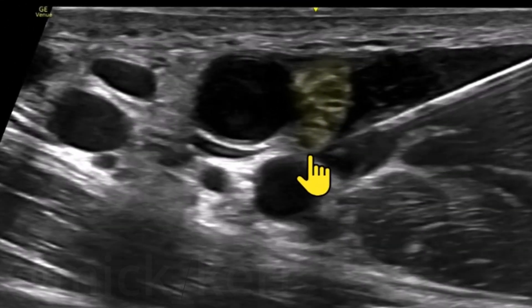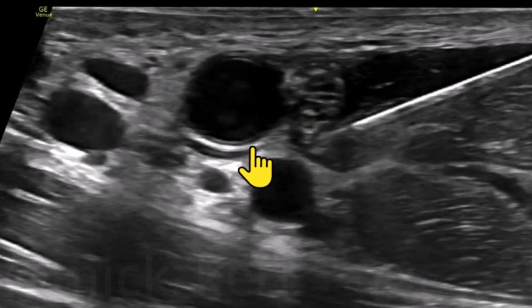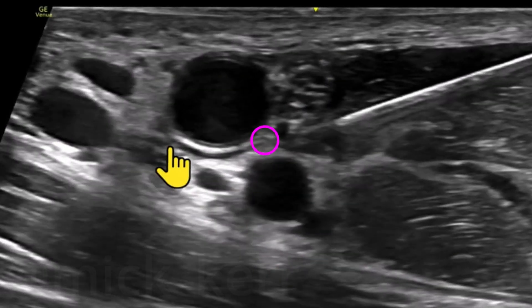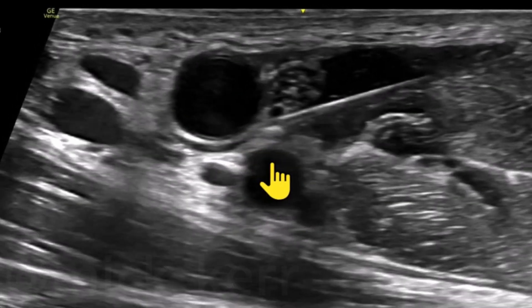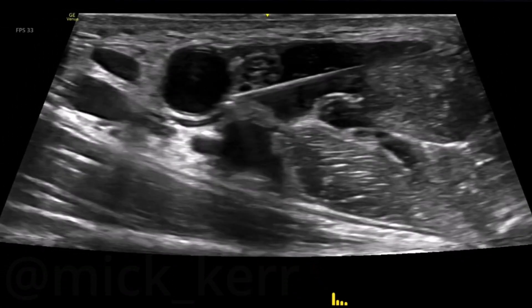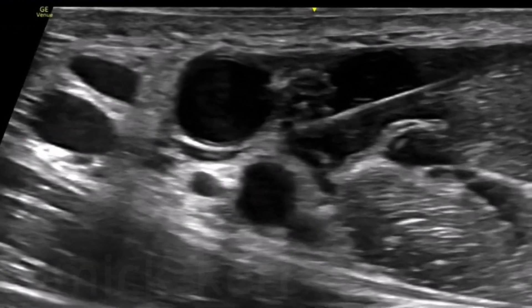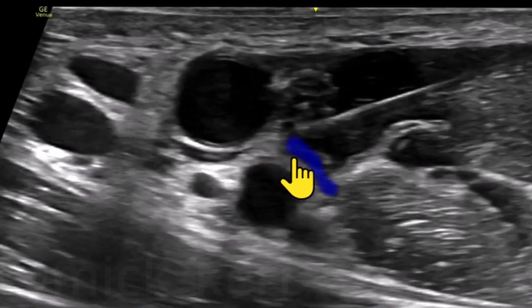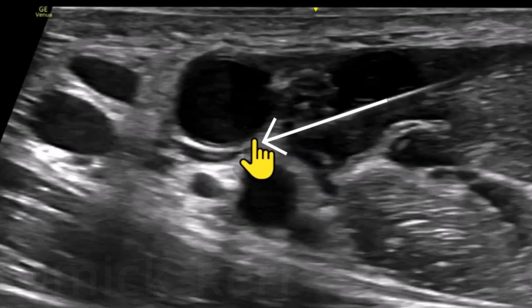I've decided I'm going to pop under the nerve and see if we can get to this little spot just about here. I've got a vein here that I'm going to keep in mind — I just want to get to about this spot here. A little bit of local just to test, and I'm going to try and use the local to open up a little space so I can have a safe passage through.